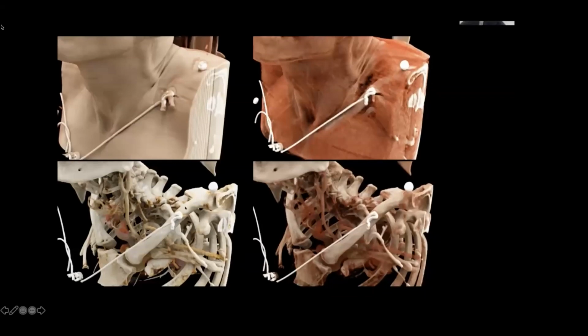Yeah. So on that basis, again, very useful when you want to be aware of, for example, vascular structures. So you can see you have your common carotid artery, your carotid bifurcation, your internal and external carotid and the various branches, and you can see the vertebral artery here. And again, there are different ways you could render this. So you could render this in a way that shows the bones a lot more clearly, that shows the granularity of the surface more clearly, that shows the vasculature more clearly, or not. So it's important to bear in mind, but again, that's what it comes back to, your question.